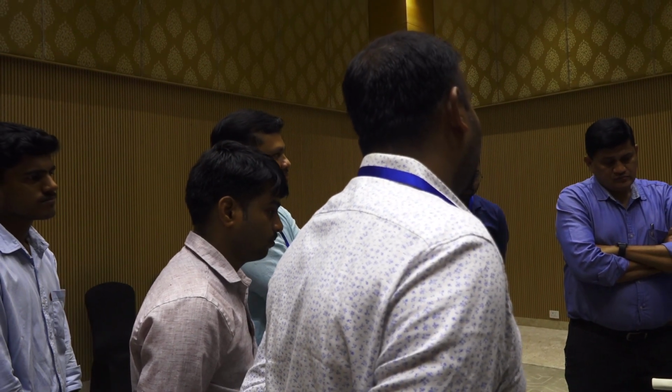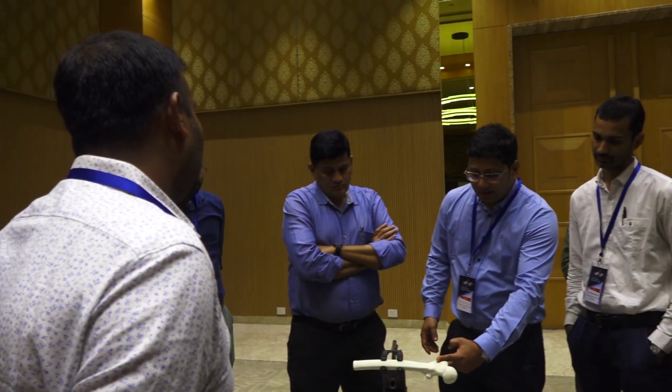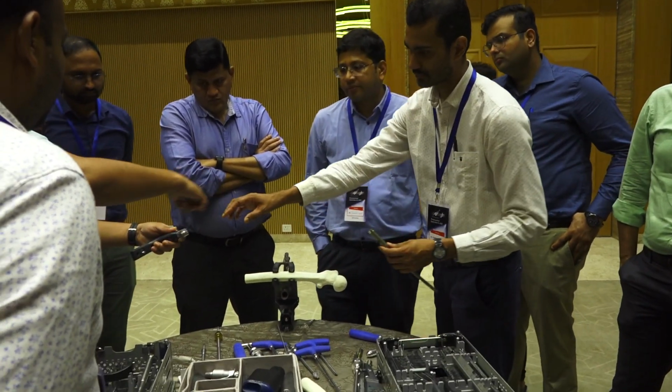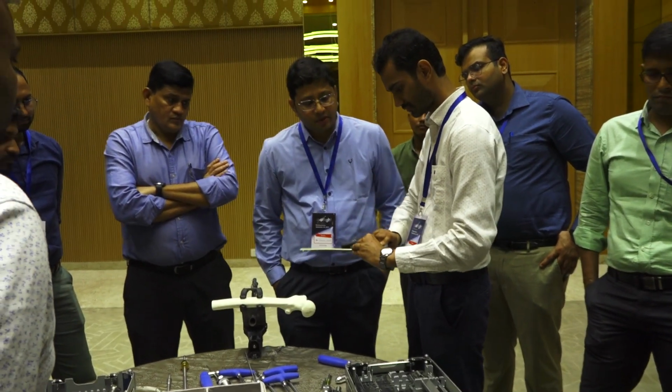In that regard, this nail system is a little forgiving in the sense of the angle at which the jig attaches to the nail. Without adducting also, you still can put the nail in there. So that is one good thing about this nail system. They have the short jig, I think. Not only short, the angle is good and the jig is short. So it will not obstruct. Yes. That is the good design perspective.